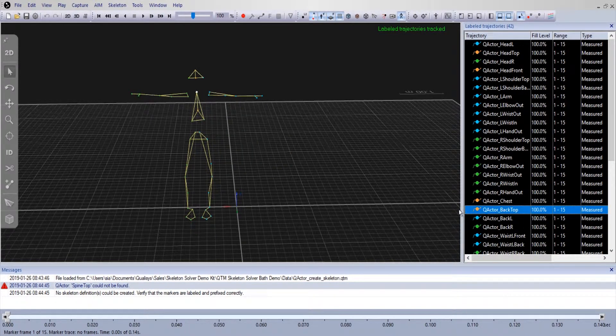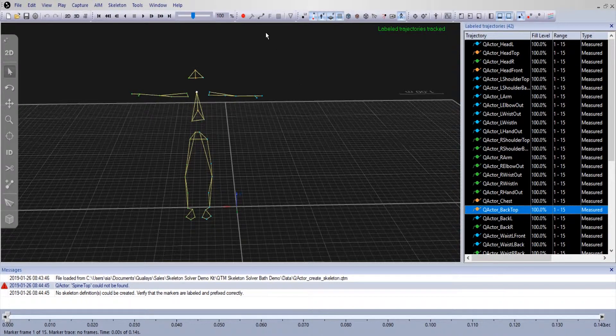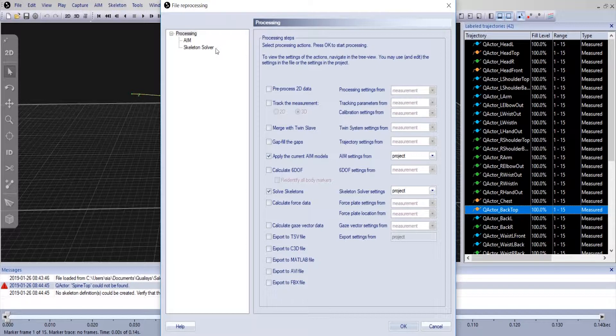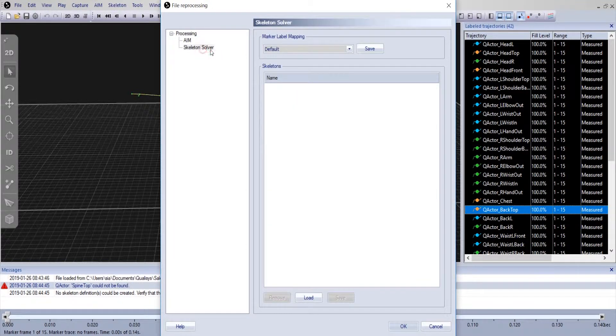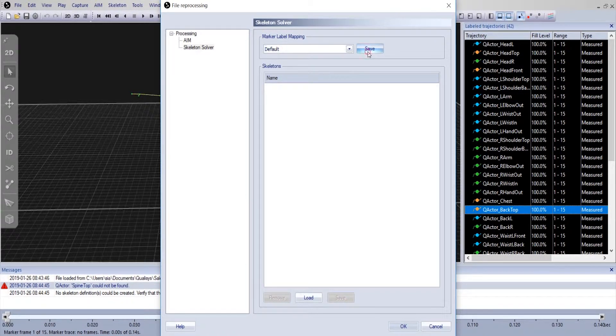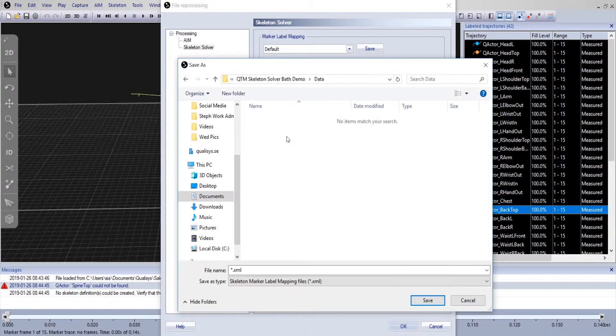To customize the marker mapping you can either go to your project options or go to reprocess the file. In the skeleton solver panel under marker label mapping, save the default list under a new name in your project folder.